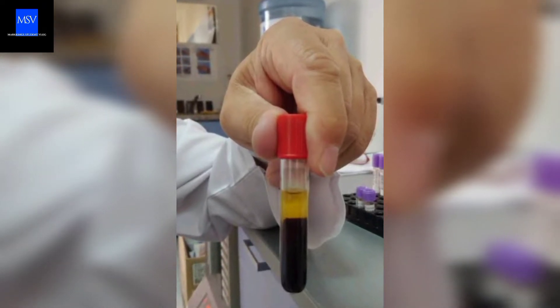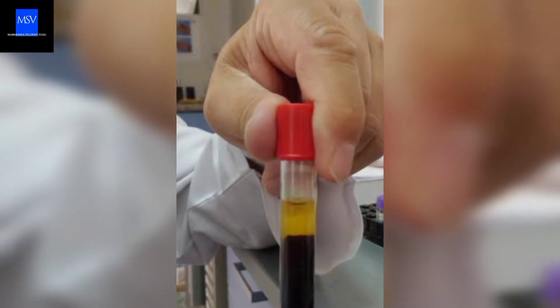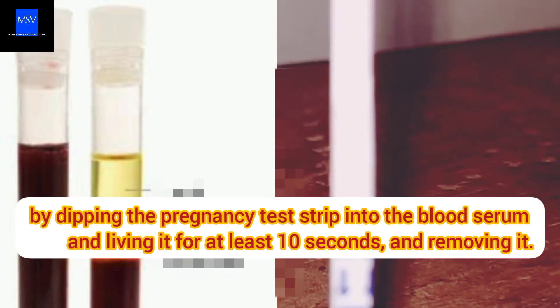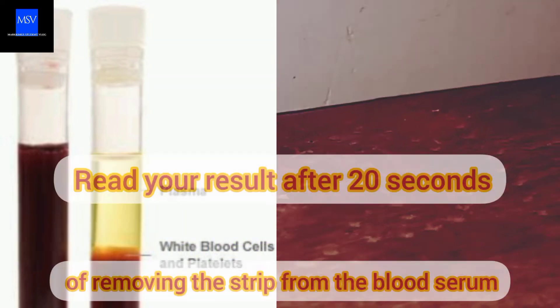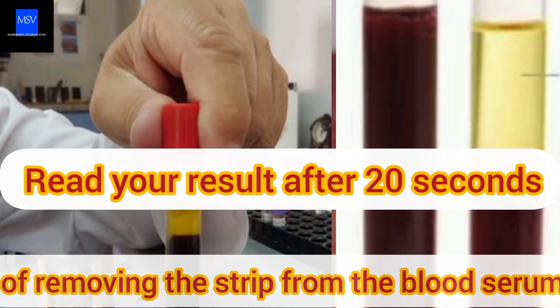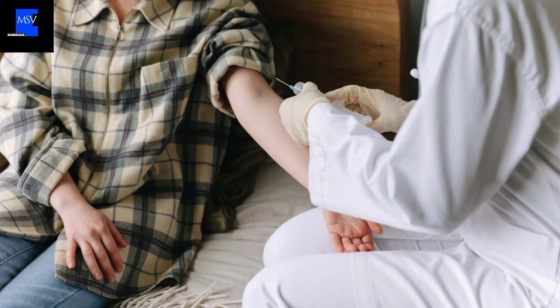Once you've gotten the blood serum, the only thing you need to do is repeat the same process just like the urine test — dipping the pregnancy test strip into the blood serum and leaving it for at least 10 seconds, then removing it and reading your result the same way. Note: if you're not a health practitioner, don't try the blood serum part, because it requires collecting blood from the body of whoever needs to be tested.